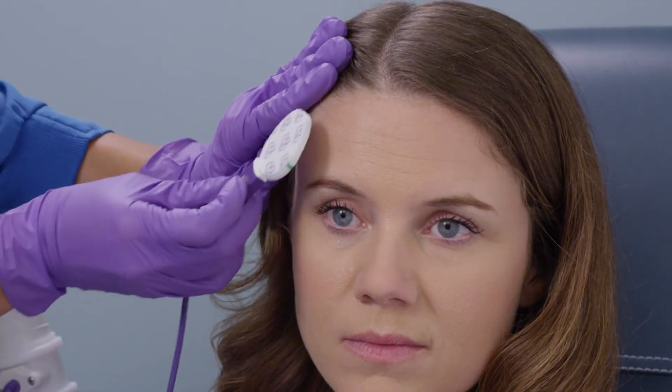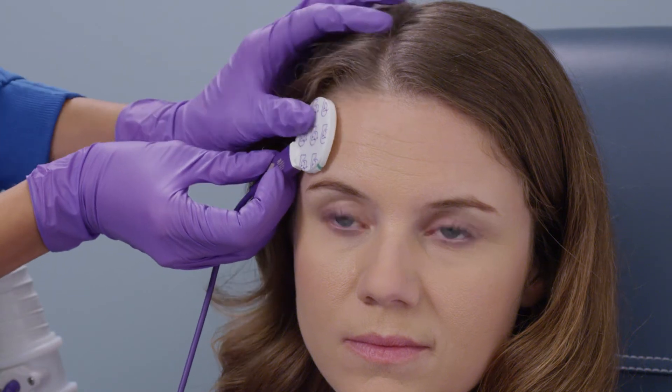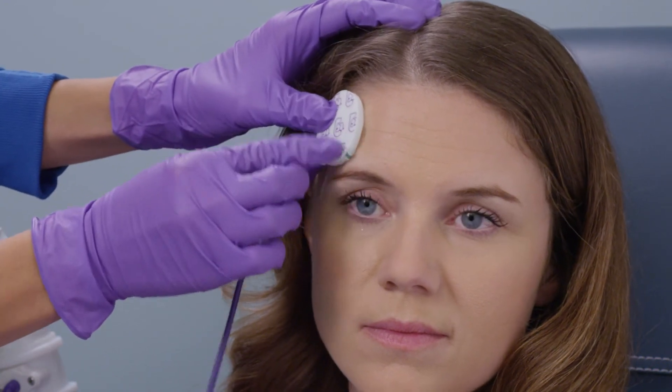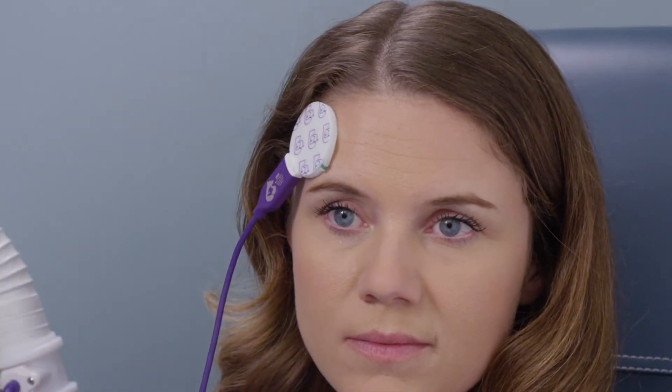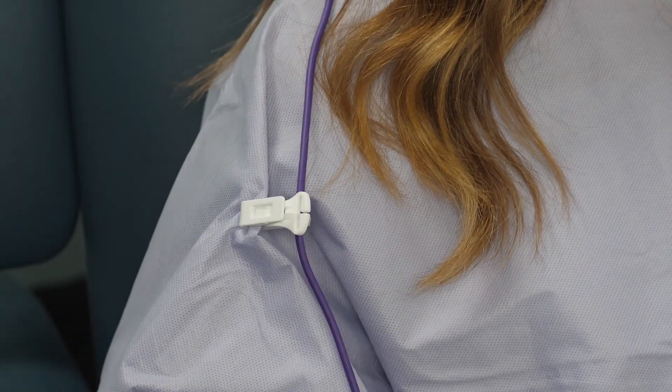Position the sensor cable away from the patient's face and apply the sensor to the patient's forehead above the orbital ridge on either side, avoiding the frontal sinuses. Do not reposition the sensor. Gently press the edge of the sensor to ensure good adhesion with the skin. If desired, support the temperature sensor cable with the sensor cable clip.